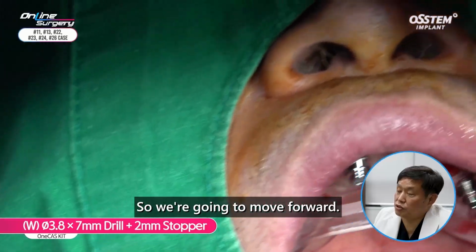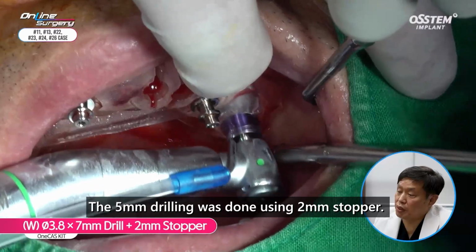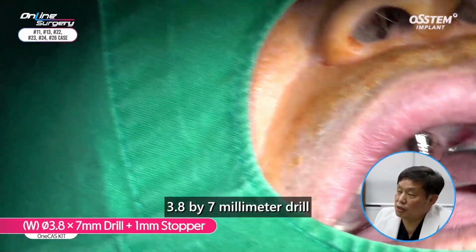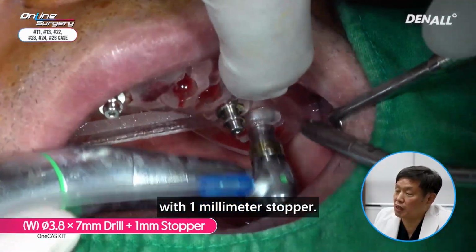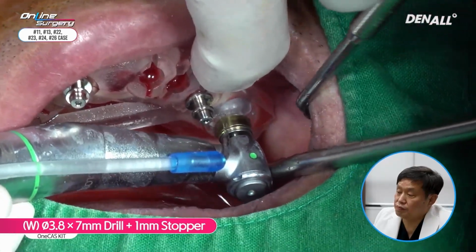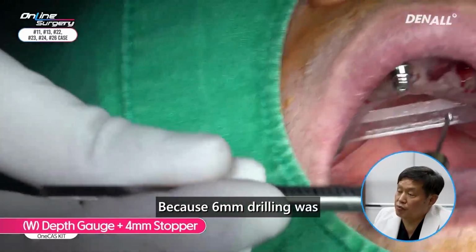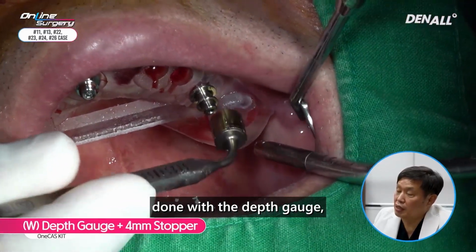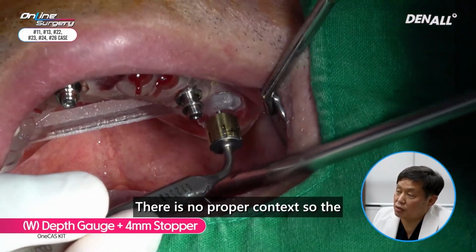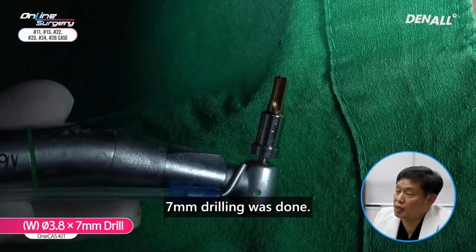So we're going to move forward. 5 millimeter drilling was done using 2 millimeter stopper, followed by 3.8 by 7 millimeter drill with 1 millimeter stopper. So drilling was done up to 6 millimeters. Because 6 millimeter drilling was done, with the depth gauge, 4 millimeter stopper was used to check whether sinus floor penetration was done. There was no proper contact, so the penetration was yet to be done. 7 millimeter drilling was done.